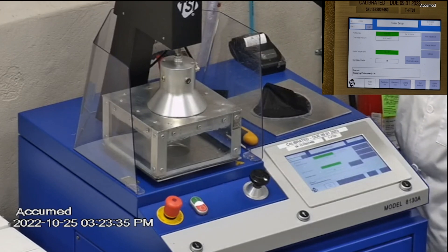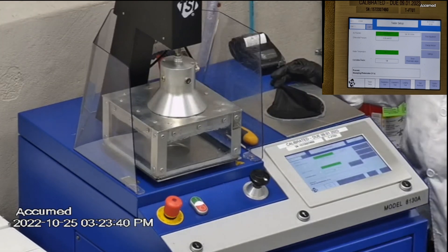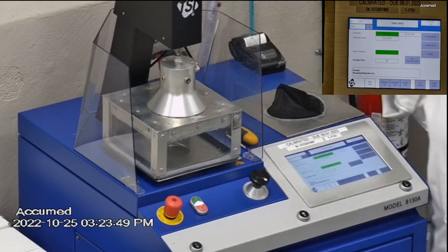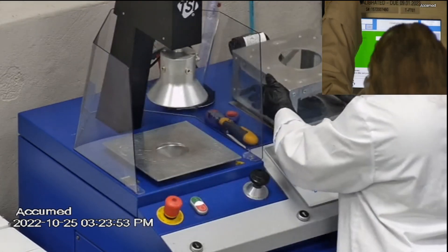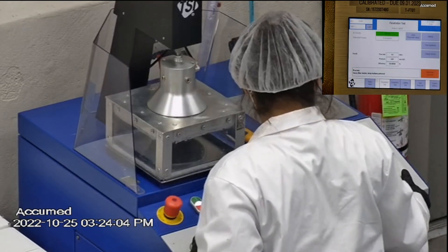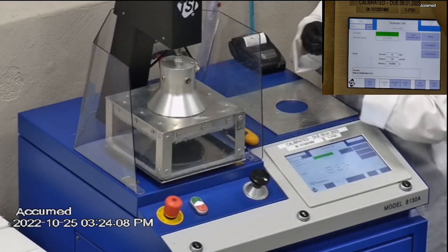F stands for airflow rate which we test at 85 liters per minute. R is for resistance also referred to as pressure drop. This correlates with breathability so the lower the number the more comfortable and breathable the mask is. E stands for filtration efficiency percentage.